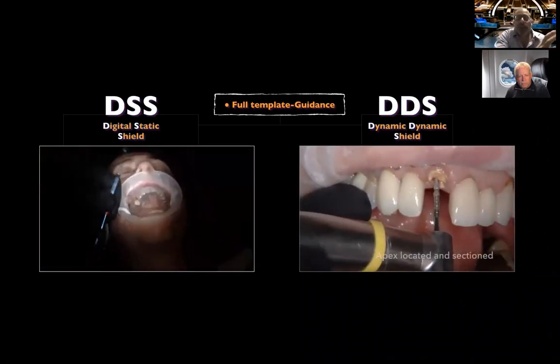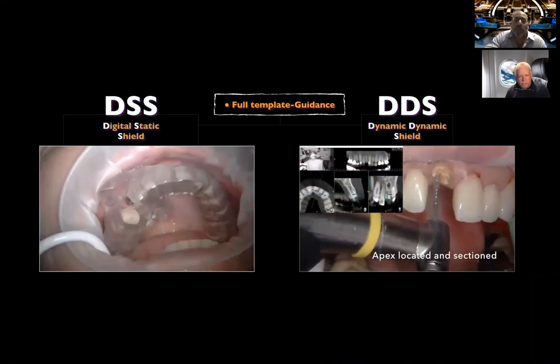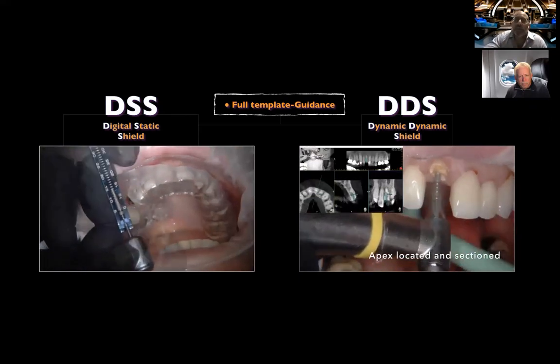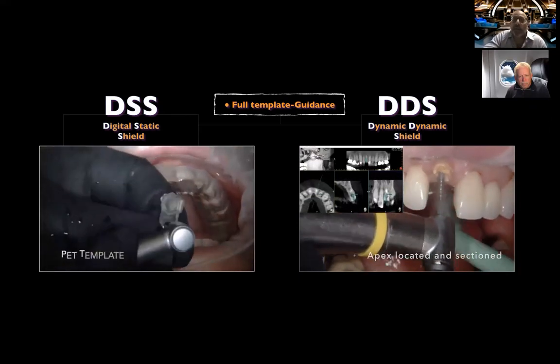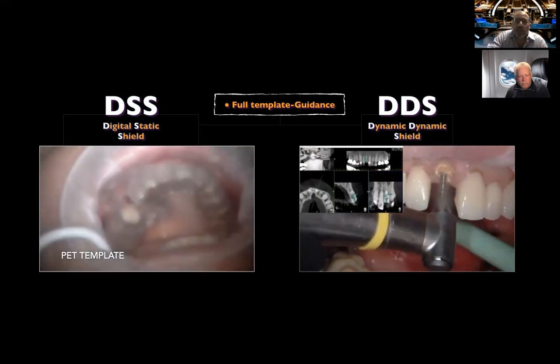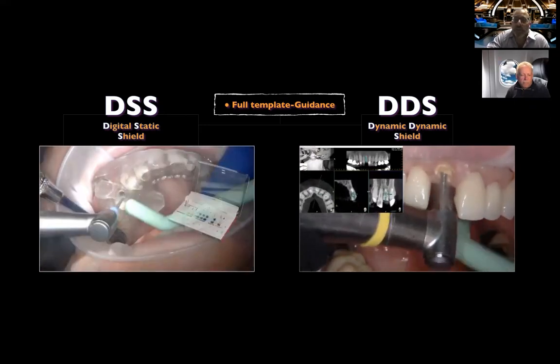We can have a static guide, which is seen on the left side of the screen, or we can have this virtual dynamic guide, which is just like having a static guide, but without the interference of a static guide. So it's a wonderful addition to the dental industry and actually to the medical industry as a whole.